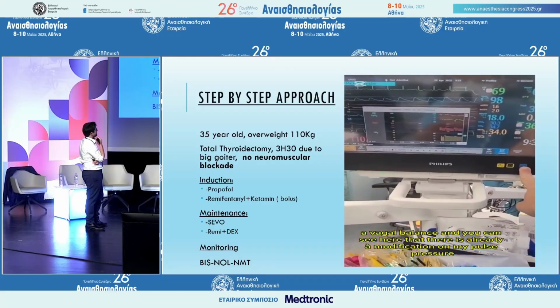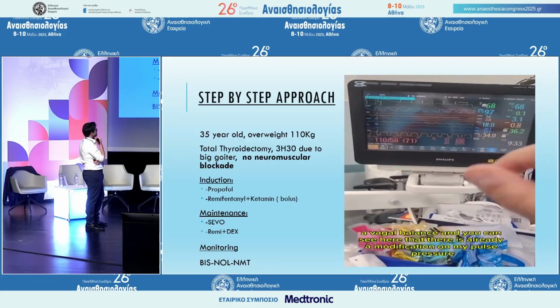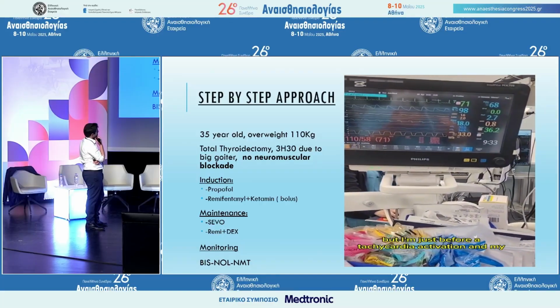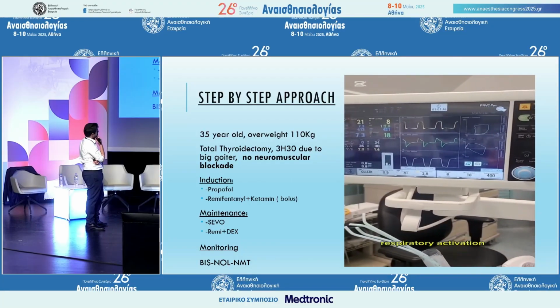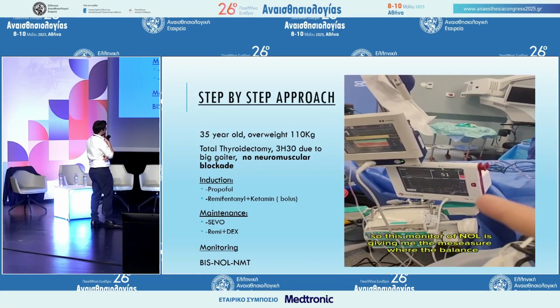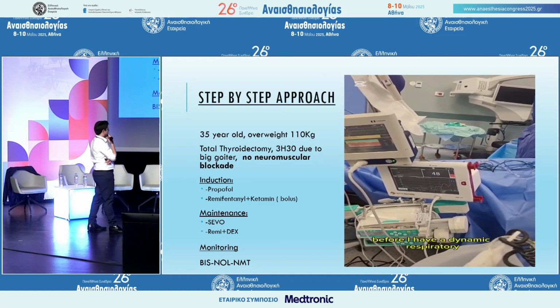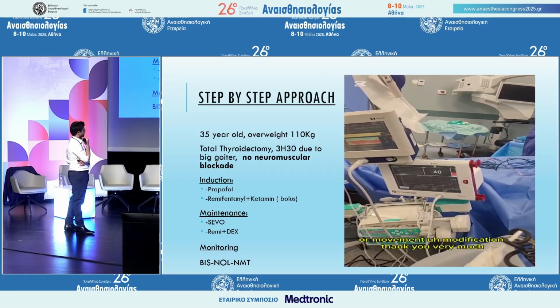And you can see here that there is already a modification on my pulse pressure, but I'm before the tachycardia activation and my respiratory activation. So this NOL monitor is showing me where the sympathetic or parasympathetic balance is before I have hemodynamic, respiratory or movement modification. Thank you very much.